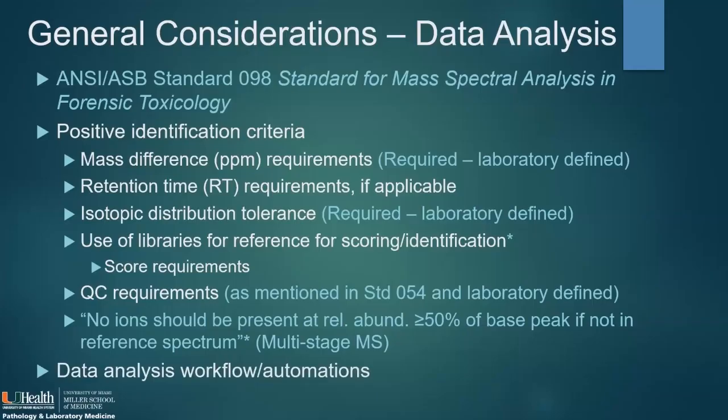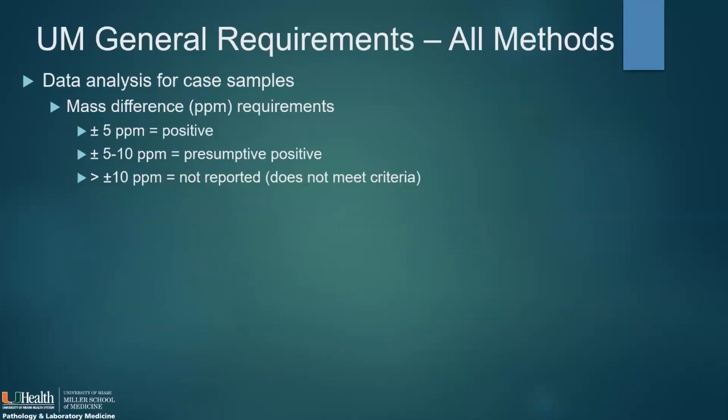And then I did also just want to consider data analysis workflows and maybe some automations. So let's jump into the University of Miami Toxicology Lab general requirements for all of our methods. And this is specifically now for case specimens and case samples.